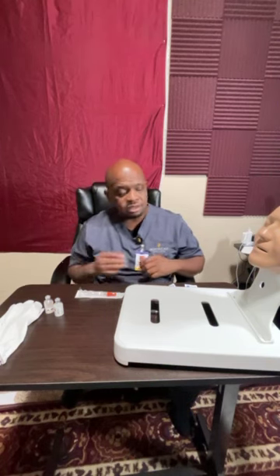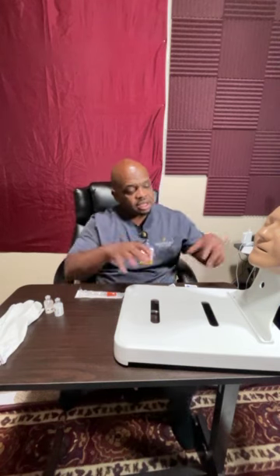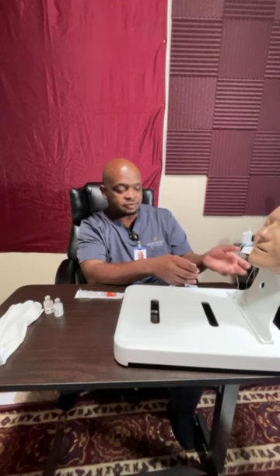The reason why I'm here is because you have a doctor's order to receive insulin every morning, 30 minutes before your breakfast. I'm going to make sure that I'm here to give that. When I'm preparing, first things first though, since I already washed my hands, I am going to check your ID if that's okay. I'm going to check his wristband and get 2 verifications of his ID.